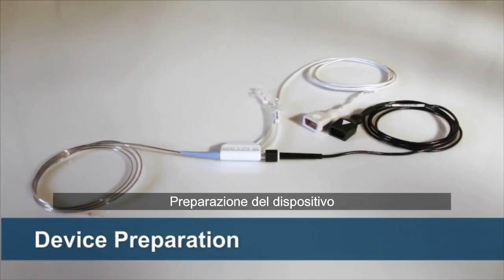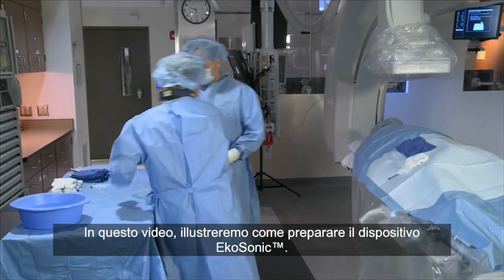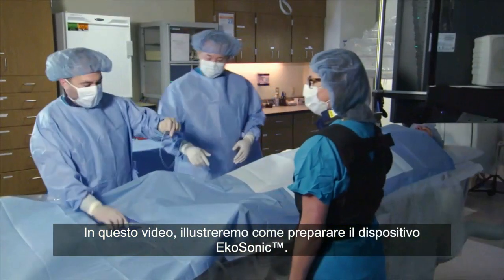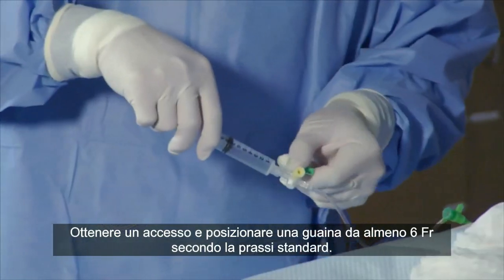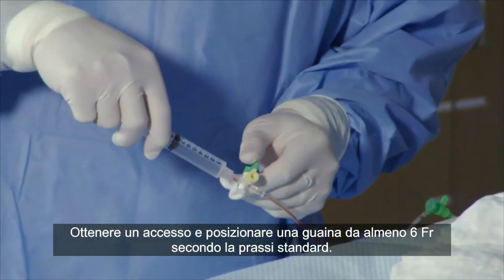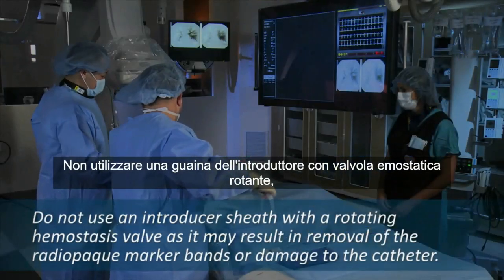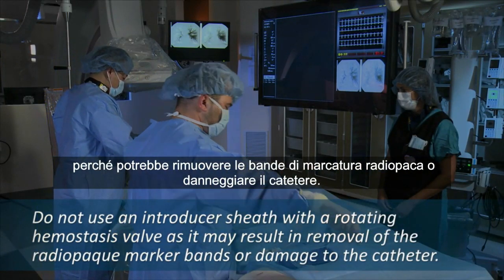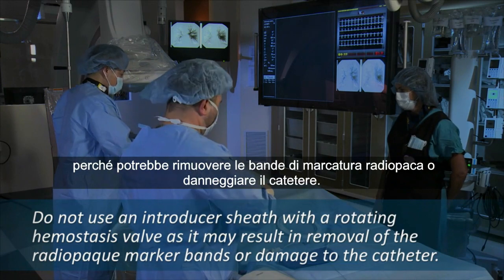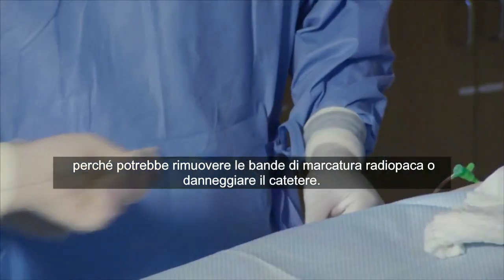Device preparation. In this video, we will show you how to prep the EKOSonic device. Obtain access and place a 6 French or larger sheath as per standard practice. Do not use an introducer sheath with a rotating hemostasis valve, as it may result in removal of the radiopaque marker bands or damage to the catheter.